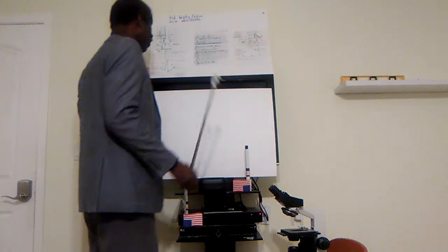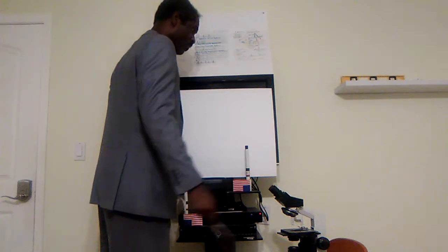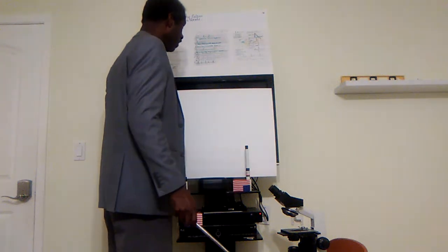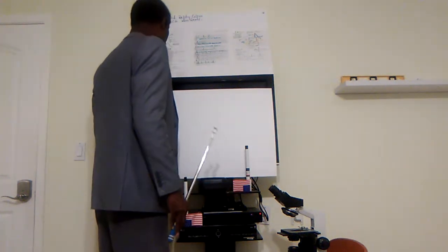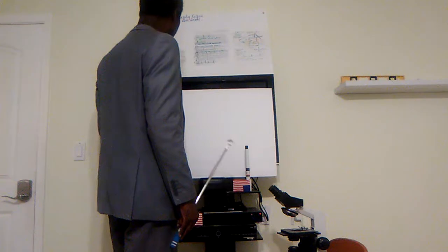And we could also have what we call a stress ECG, and this one is taken with the patient running on a treadmill, with the electrocardiogram leads attached to the patient and the measurement of the ECG obtained. So there are two different types, the resting ECG and the stress ECG.